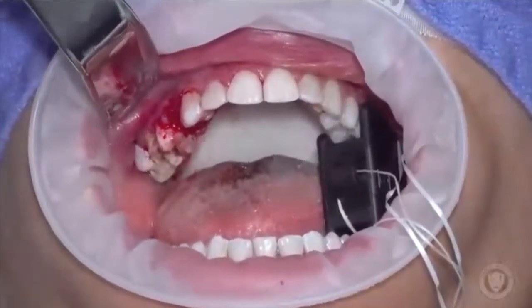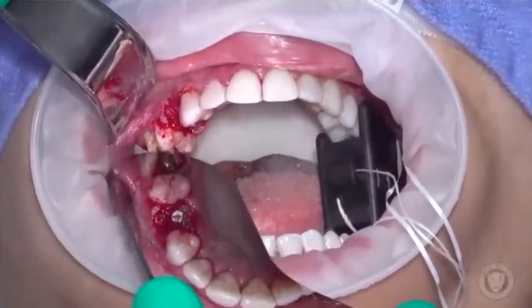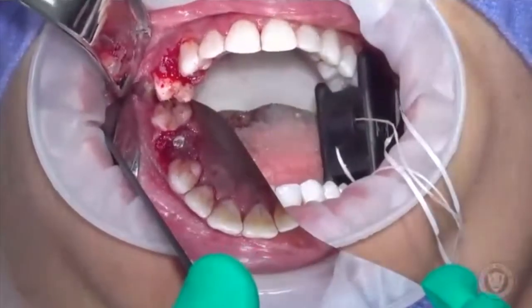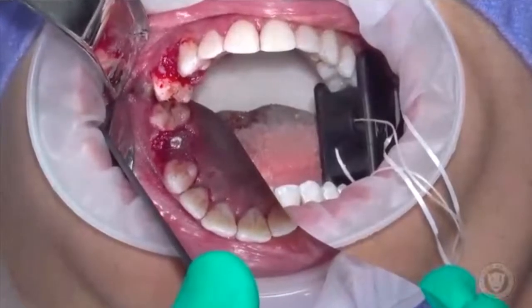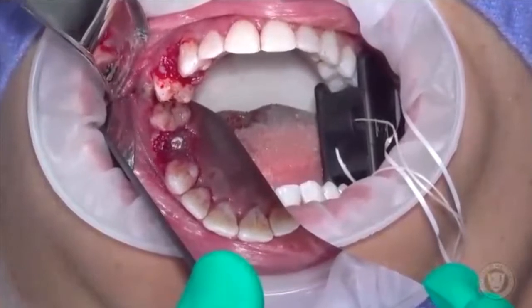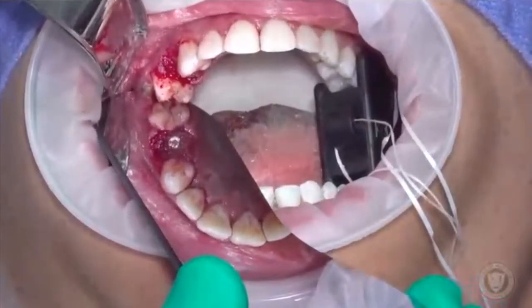What's neat about this is look at the hemorrhage we have here — it's almost next to none. I like the analogy of the fighter in the ring when they get cut and use Vaseline to help reduce the bleeding. So we have very little bleeding. When we do a case like this and the patient leaves, even on an extraction site, they're leaving and they're not hemorrhaging. And this is a really good practice builder.